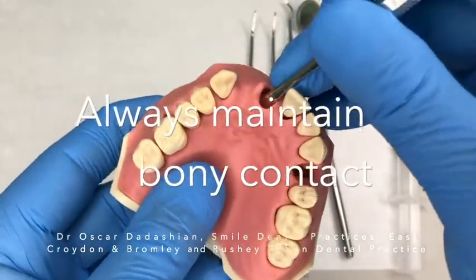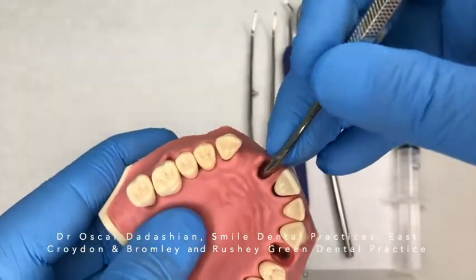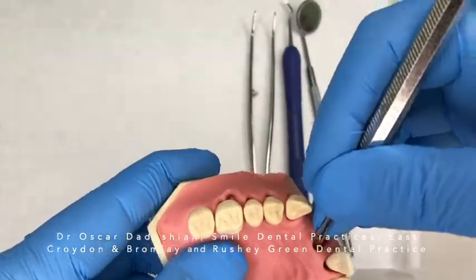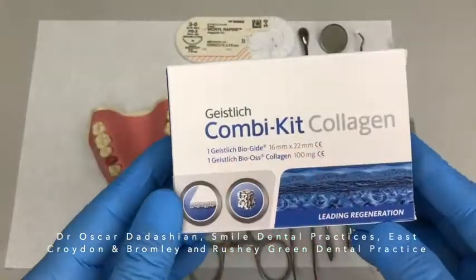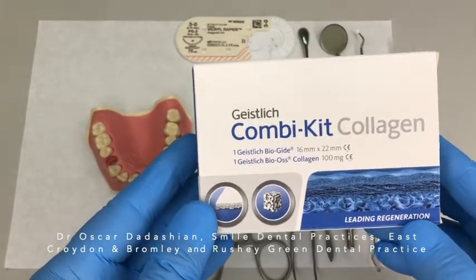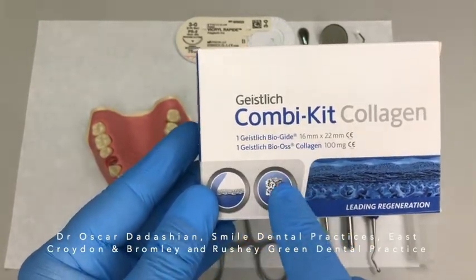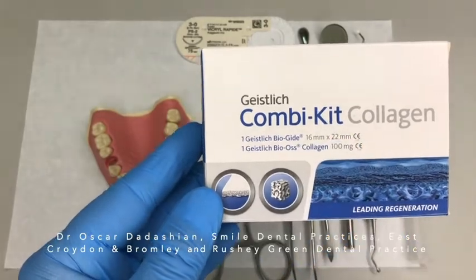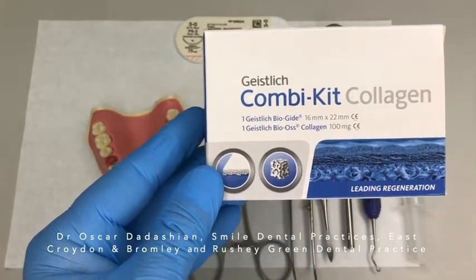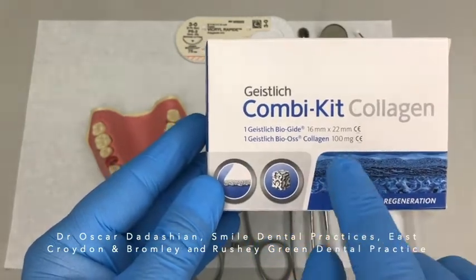At all times maintain bony contact, so even when you're undermining the soft tissue at the palatal surface, come up from the bottom of the socket, reach the lip, then go beyond it and maintain bony contact. We are going to be using the combi kit which contains Bio-Oss Collagen. Bio-Oss Collagen contains 90% Bio-Oss particles and 10% porcine collagen. The added 10% collagen helps with building new blood vessels and bone, and also allows space between the Bio-Oss particles so they are not crushed into each other.